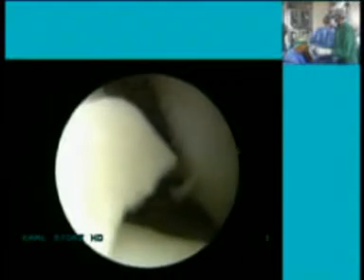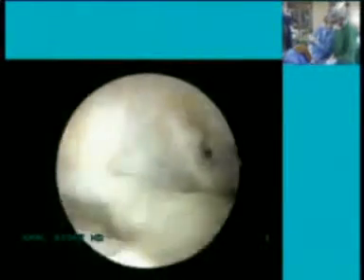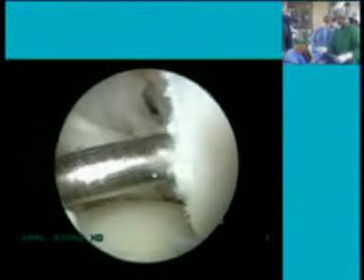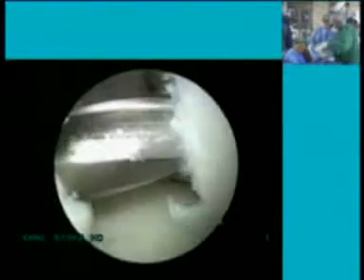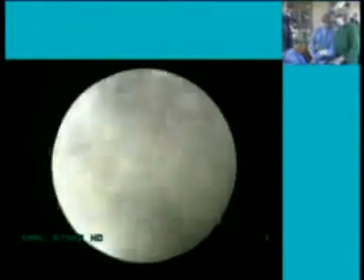So personally, no, not a single one. When would you do a double bundle reconstruction? In my practice, around 20% is double bundle, and the selection is basically based on the high demand patient. And do you like to measure the footprints as well to see if they would satisfy, if they would take double bundles, any criteria of that sort? Yeah, definitely. Once you prepare that, I check if there should be enough space there, and I generally customize the graft according to the footprint.